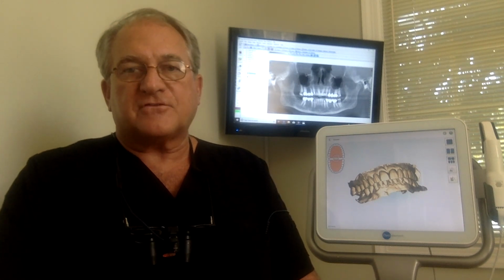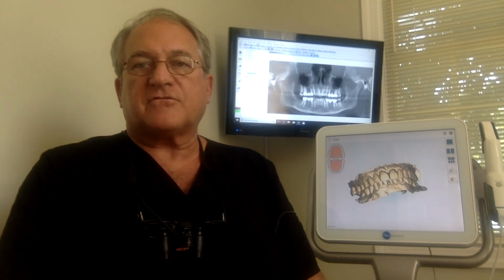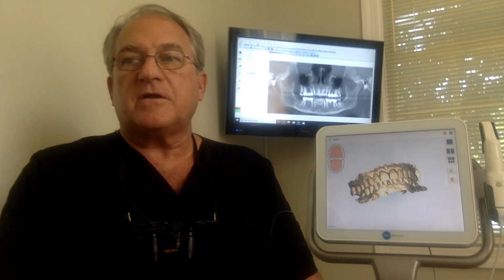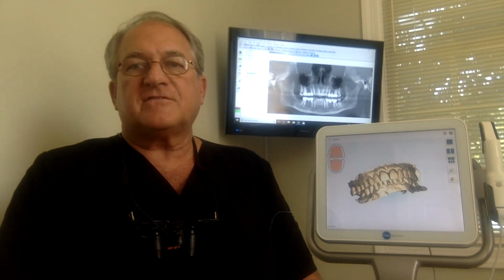In this particular case, there was an example of a black triangle, and we used some principles from Dr. Tarnow to reduce the size of the black triangle that existed between the patient's front teeth. The article may be of interest for doctors who are interested in pre-making their provisionals and making custom-fit provisionals that satisfy the highest level of aesthetics.